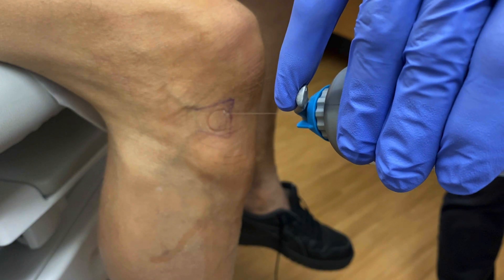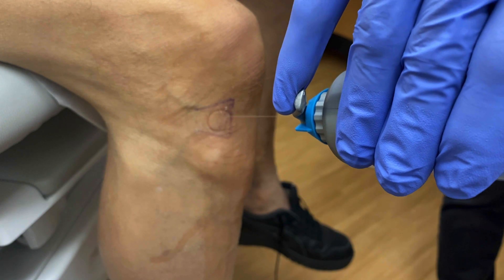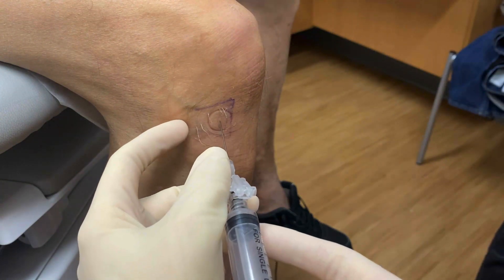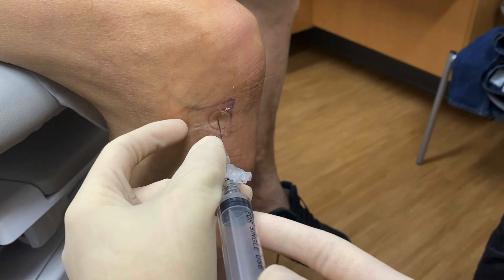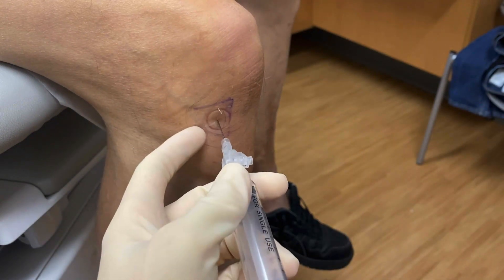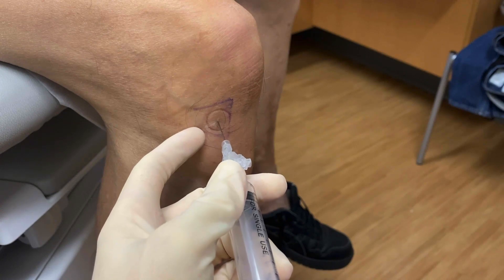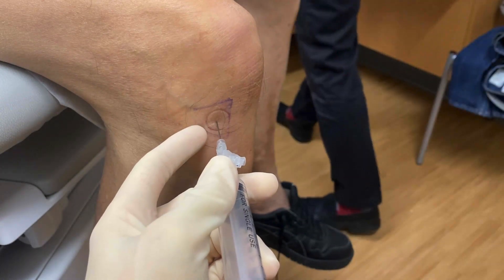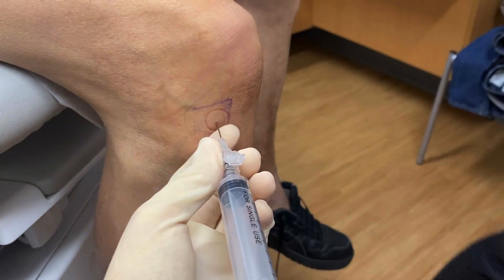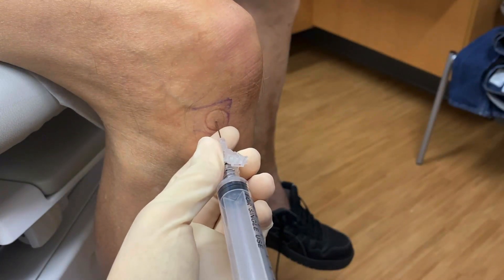You can use ethyl chloride spray to numb the skin before inserting your needle. Then enter the skin perpendicularly while pulling back on the plunger until you see a flash of synovial fluid. At this point, if you need to drain an effusion, you can do so by continually pulling back on the plunger. In this case there was nothing to drain.